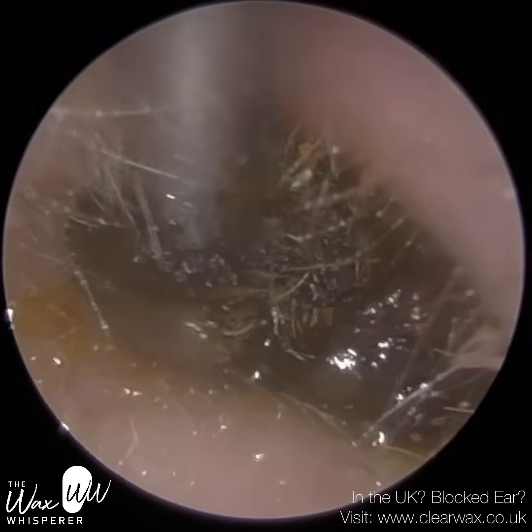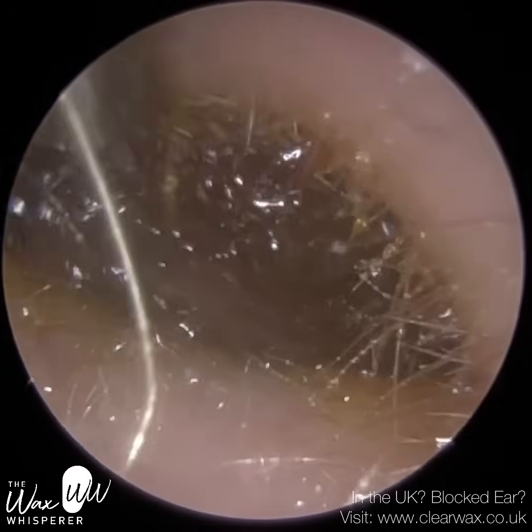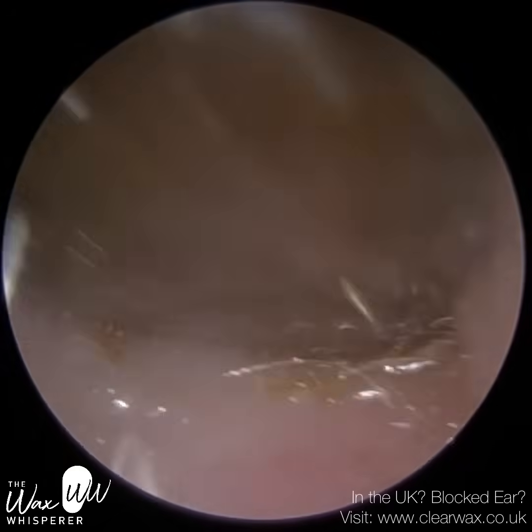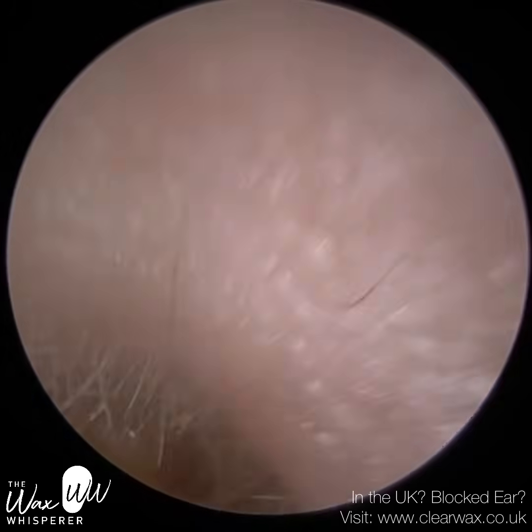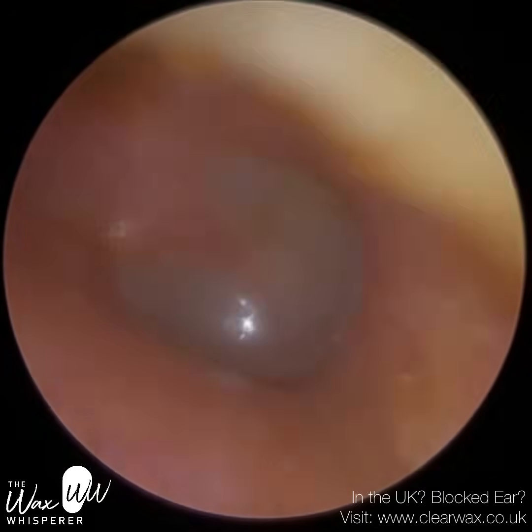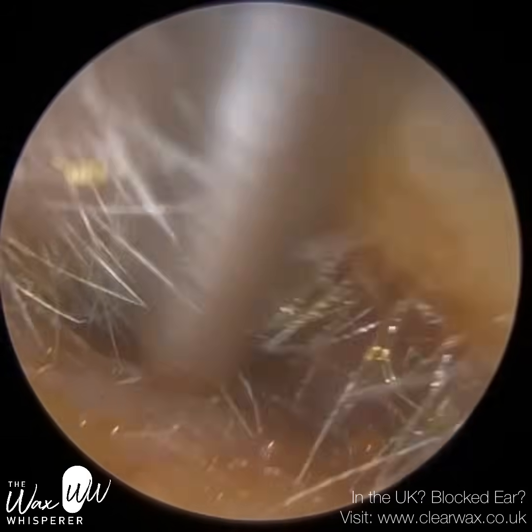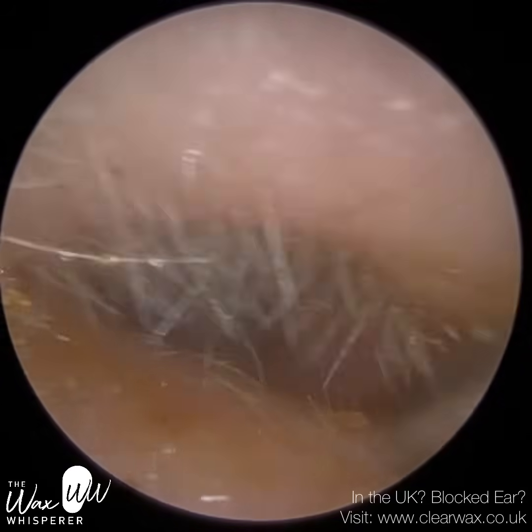We're just at the entrance now — this is the region between the first and second bend, known as the isthmus, which is part of the ear canal. Just going up and down with the plug, I've managed to tease that away. You can just see how dark that was — so it's been there for a while and it's oxidised. That's the patient's eardrum — it's nice and healthy. I'm just going to mop up some of this loose wet wax just near the entrance. It's just a bit of staining caused by the olive oil spray.